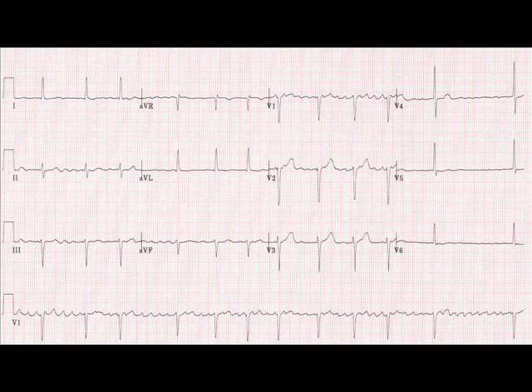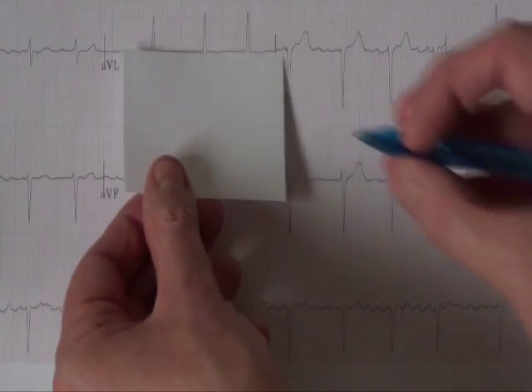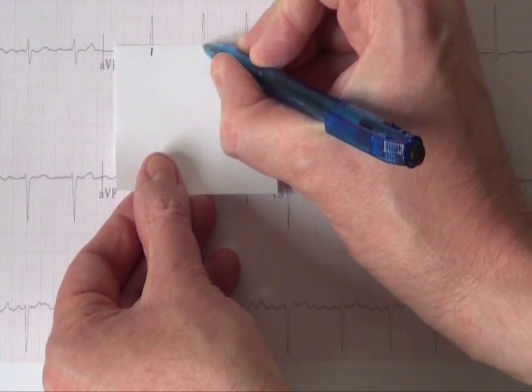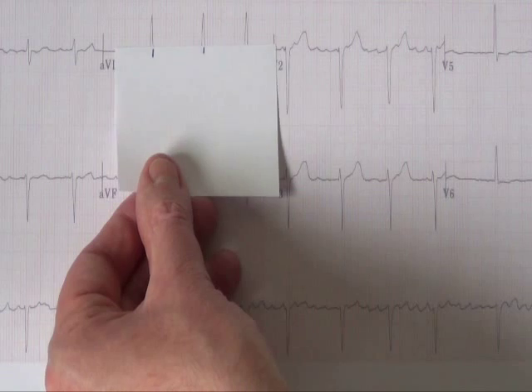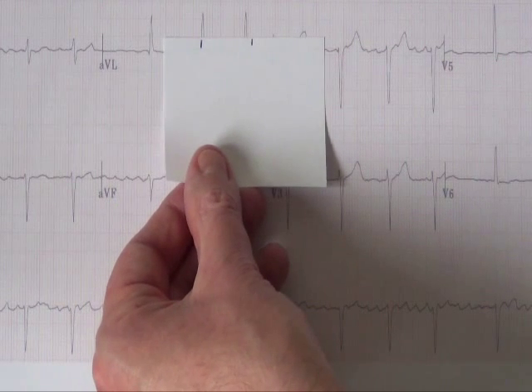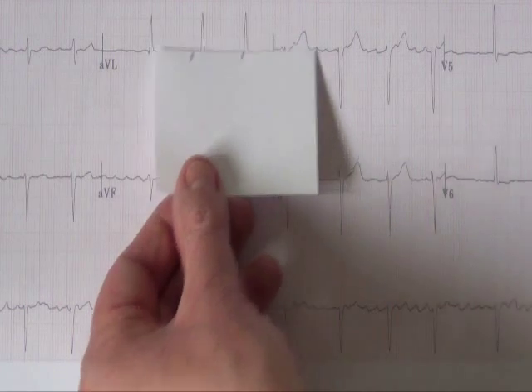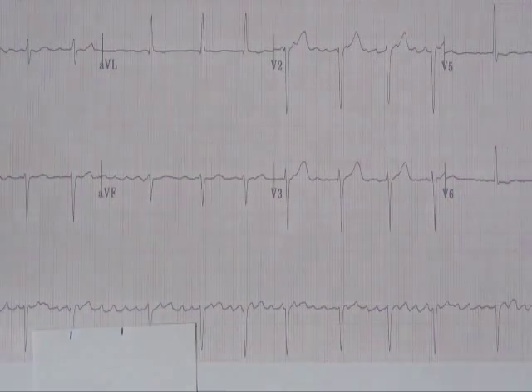However, here's a tip. When atrial fibrillation is particularly fast, it's difficult for the naked eye to see that variation in the gaps — even when you take the pulse, it's difficult to ascertain that irregularity. Therefore, take a piece of paper and lay it on the R waves on the 12-lead. Mark off two to three R waves. When you move the piece of paper along, if the heart rate is irregular, the subsequent R waves won't fit over those marks on the paper. If it is regular, they will fit.